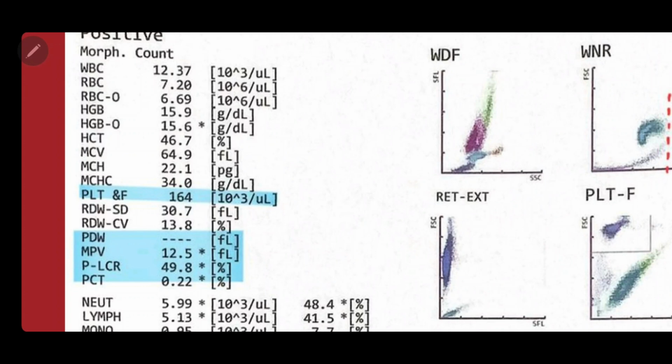First, it's essential not to memorize standard values like a dog's normal platelet count being between 200,000 and 500,000. Each animal has individual normal values for red blood cells, white blood cells, and platelets. To determine if a platelet count is an individual normal value for a specific dog or cat, we look at the IPF.